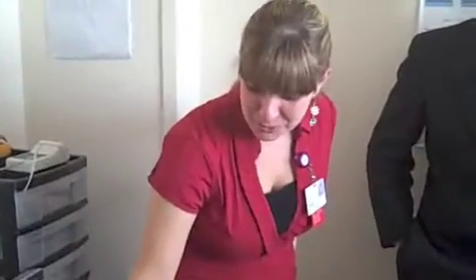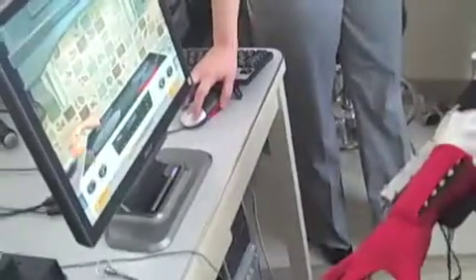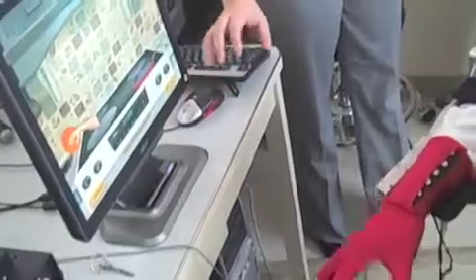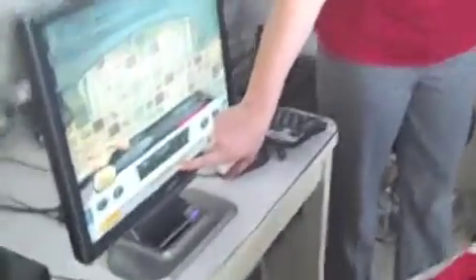Other features of this device include the egg-tracking exercise. If the user pushes too hard on the egg, the egg is going to break, so the force sensor has to stay somewhere between the red and the blue bar. The glove was calibrated on my hand, which is smaller, so a larger glove would be needed to control it better.